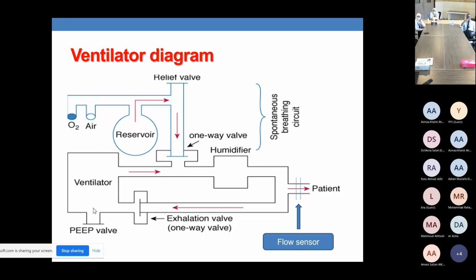According to the setup, what you put as a setup, this pressure will be translated as volume guarantee, or how much numbers you want to get. But the job, just to keep in mind, is that the job of the ventilator is to generate pressure. So this air coming in the tubings goes to the humidifier, then to the inspiratory limb, then to the patient, and from the patient back to the expiratory limb, and nearby the ventilator.